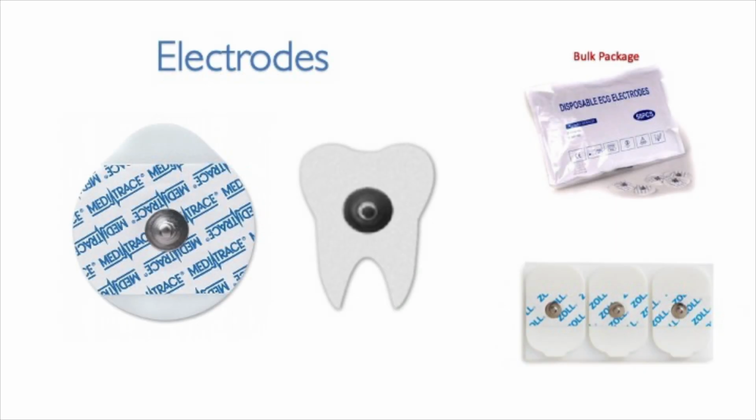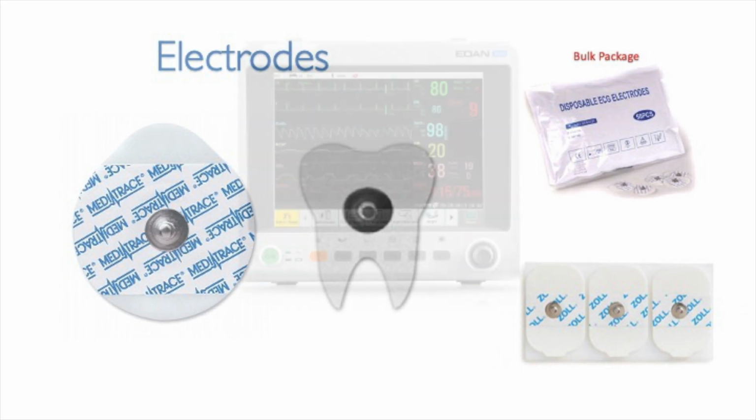Keep in mind that ECG pads, also known as electrodes, need to have sufficient amount of gel in order to function properly. If using from a bulk package, seal the package between each use. It is a good idea to connect the lead wires to the electrodes prior to placing them on the patient.